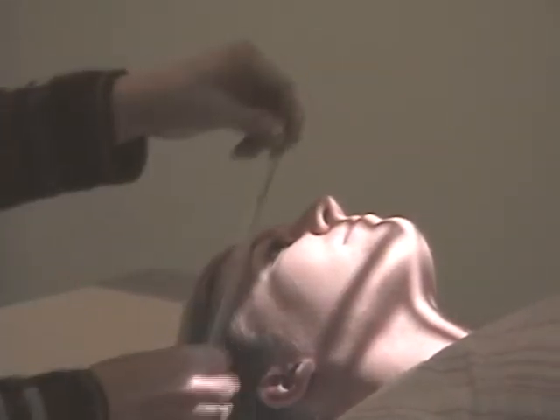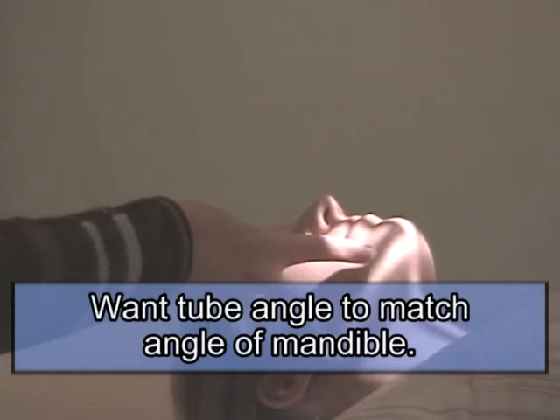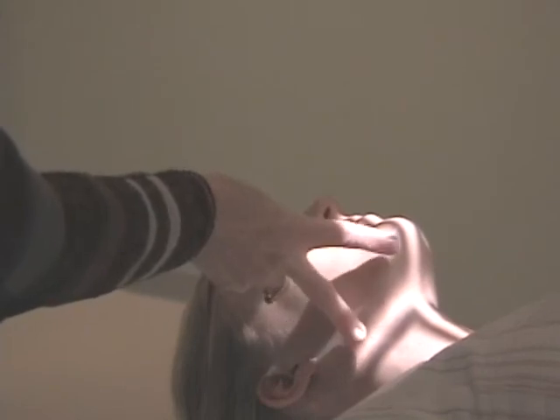And here's the trick. You want the tube angle to match the angle of the mandible. And I'm a little bit too much angled with my tube, so I'm going to lessen that degree of tube angle just a little bit. And then I will be more in alignment with the angle of the mandible.